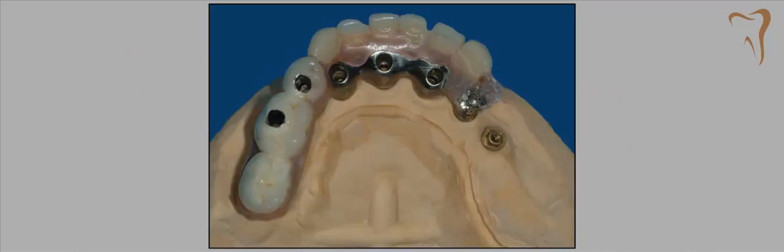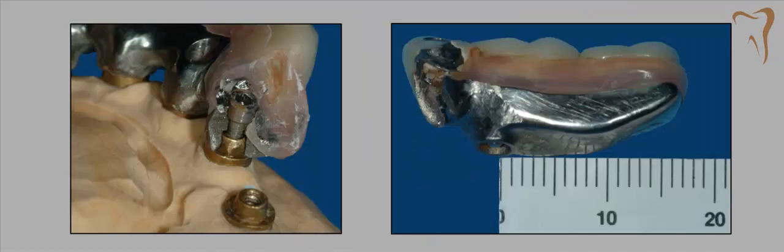So look at this one. This is like a 15 millimeter posterior cantilever case that fractured, and it did about 4.5 years on this titanium framework, and the lady was about 88 at the time. So you can see that it wasn't a surprise when Maureen lost it there.